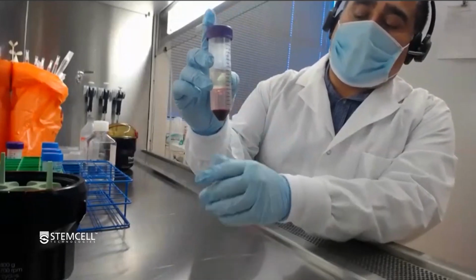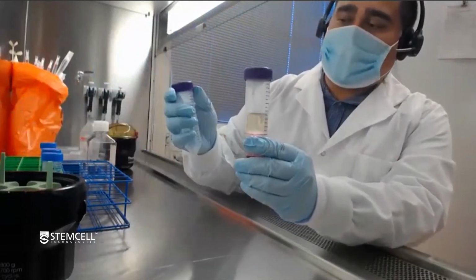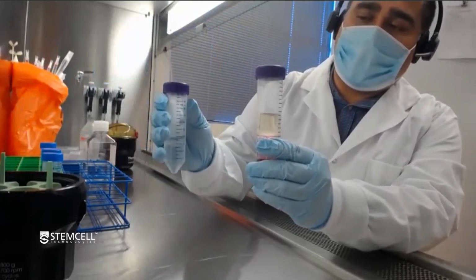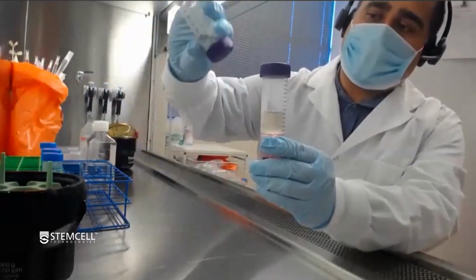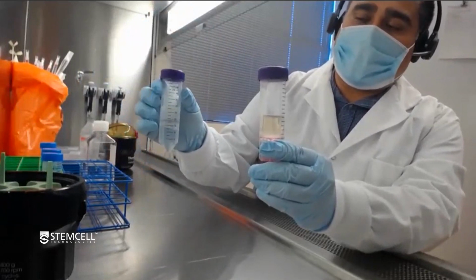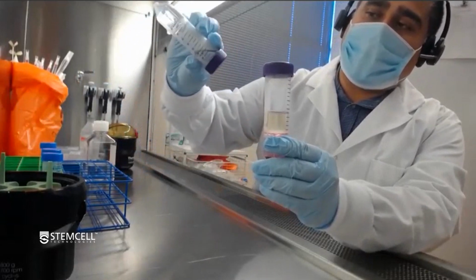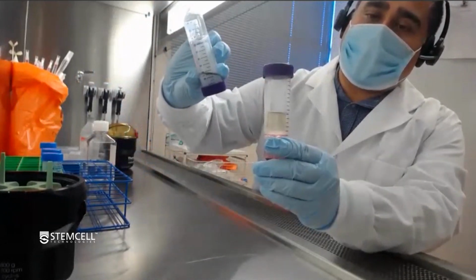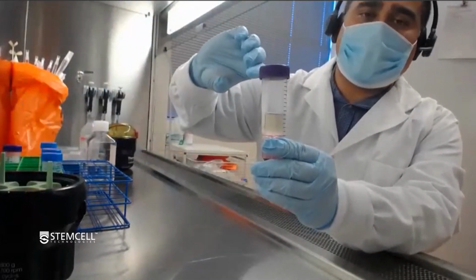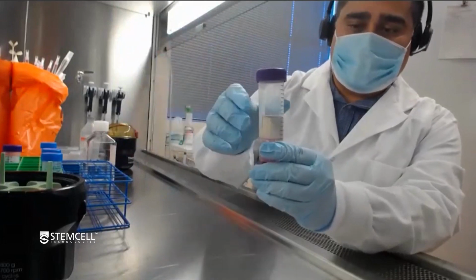The idea is that when you pour this, what you want to do, with the cap off obviously, is that you want to do this in one smooth, confident motion like this. Okay? You don't want to be hesitant, because if you're hesitant, when you're going through the diagonal, that's exactly when the layer underneath can come out. So one smooth motion, wait for 1, maybe 2 seconds, and then back.